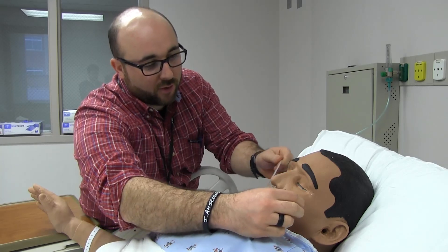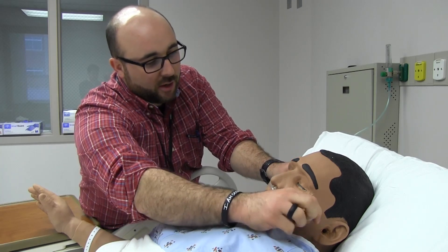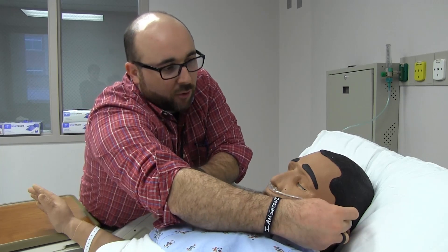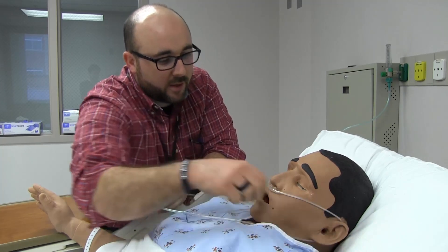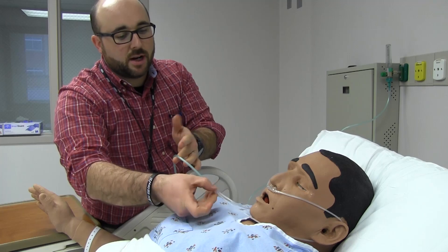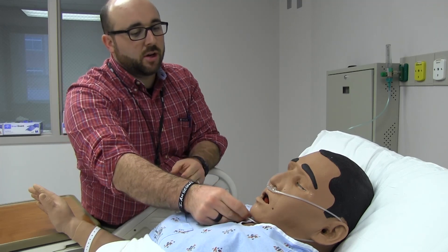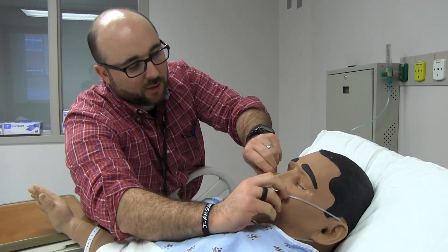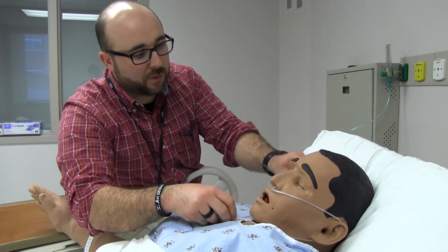Curving back, I always put it in the nose first with a little bit of pressure. Then I put it around this ear — going over the ear and under the chin. This piece right here kind of cinches it. You don't want to go too tight, just enough to secure it. Then sometimes I do a little adjustment to what feels best for the patient.